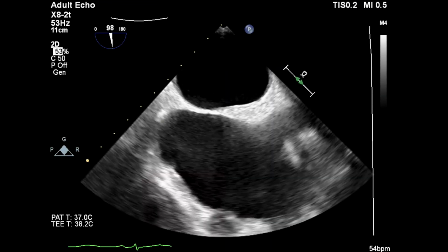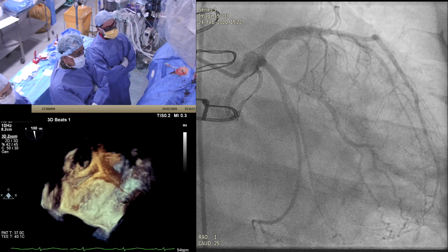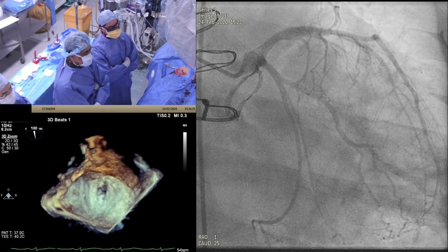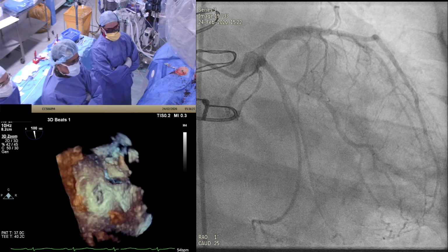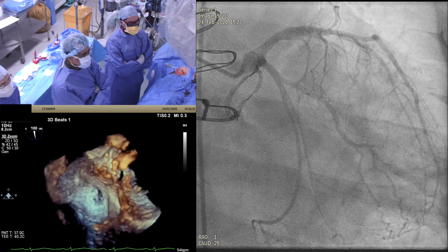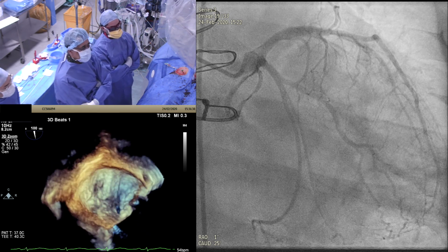Hemolysis becomes an issue. I think an ASD device, because it's circular and plugging that hole with a waist, also has the advantage that you have the two discs on both sides that may bring all of that together, both from the LVOT side but also the LA side, and in theory could potentially exclude that whole pseudoaneurysm patch area that does have quite a lot of flow going in and out of it. So I think after this most up-to-date imaging, that would probably be my first preference.